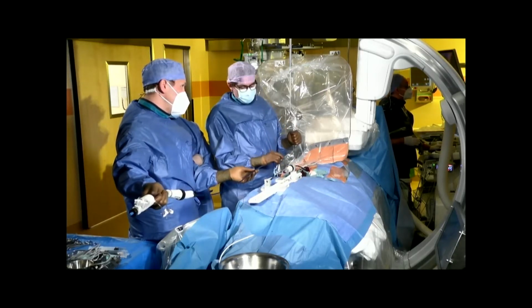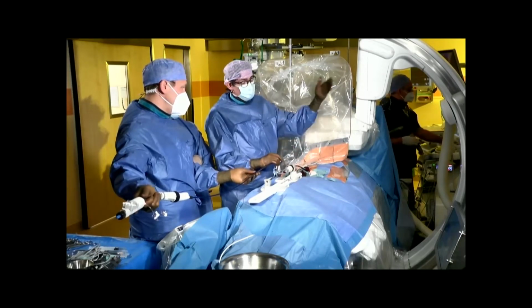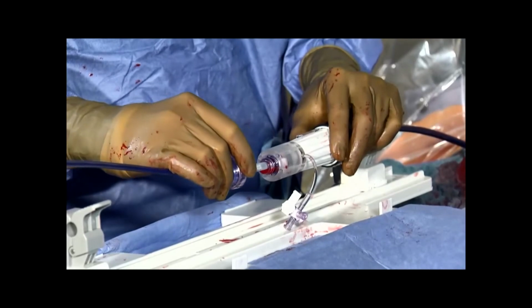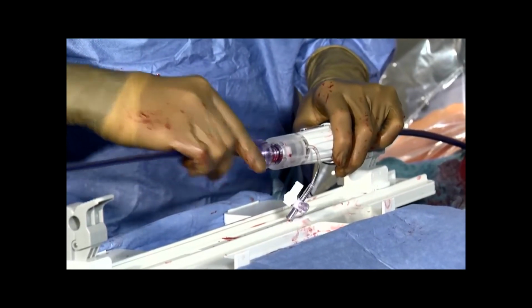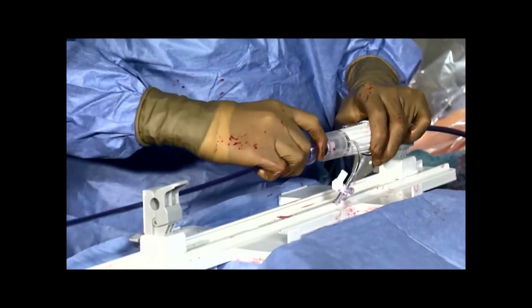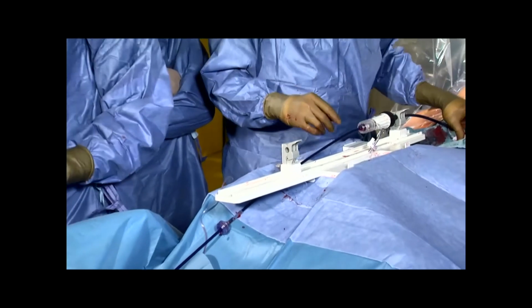So in other words, I believe that the grasping force is higher with the PASCAL ACE, and in a very dynamic environment like this one, I really would like the leaflets to come together as closely and as firmly as possible, but at the same time preserving the leaflet and not causing any harm or injury.